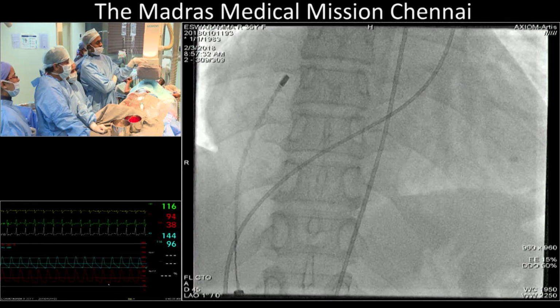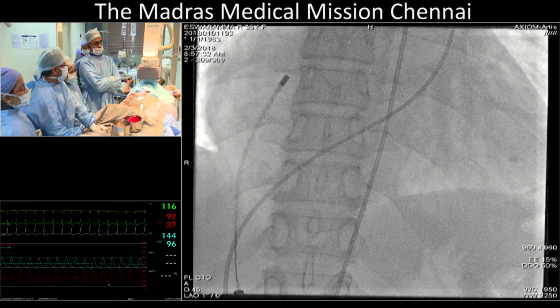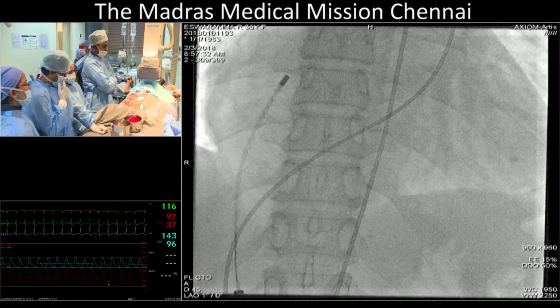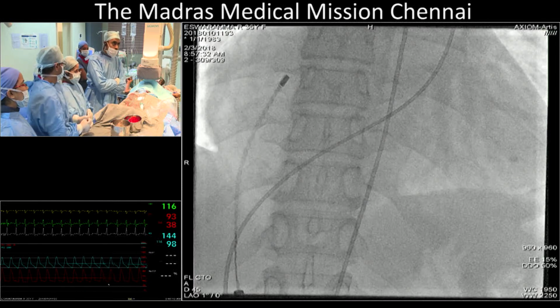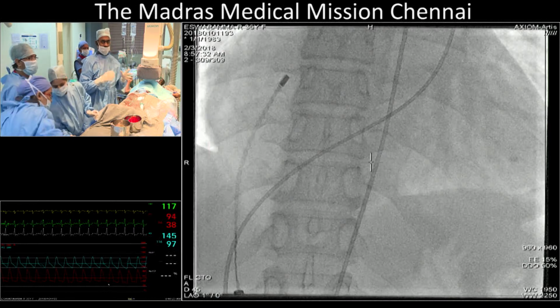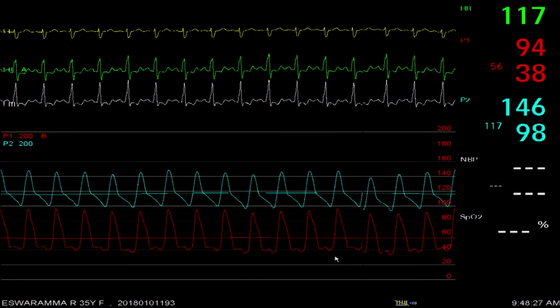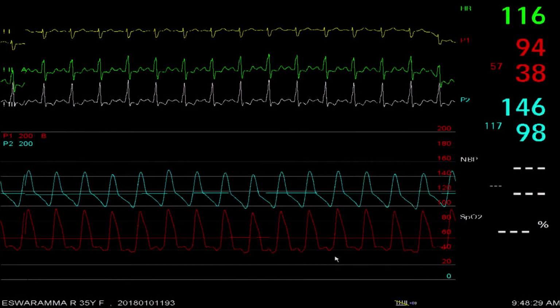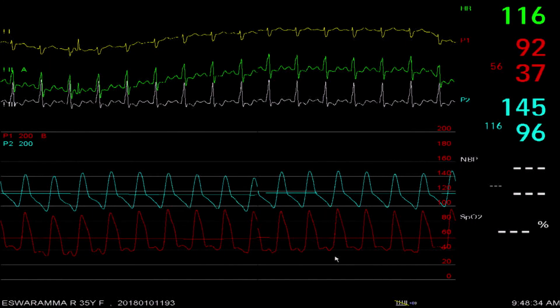Zahid, this is the pulmonary artery pressure after 20 minutes of oxygen now. What was the saturation 6 months ago at rest in room air at home, or even today in the clinic? Normal, 98%. Even today is normal. Okay. Is it spontaneous breathing? Hello? Spontaneous breathing, the patient? It is a normal sinus rhythm. Yeah, we can hear you.